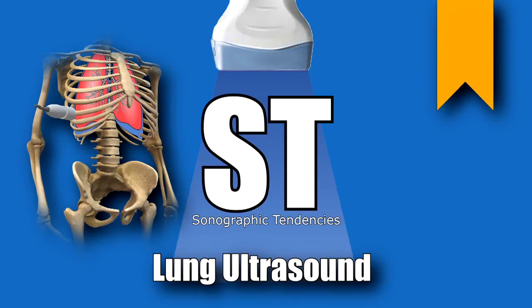Hey there, continuing on from our coronavirus video, I'm going to cover chest and lung ultrasound, or thoracic ultrasound. We use thoracic ultrasound to image the lung, pleura, and soft tissues. Lung ultrasound is particularly useful in critically ill patients and patients with infectious respiratory conditions like pneumonia, or other conditions like congestive heart failure.